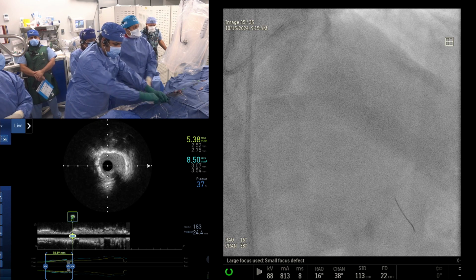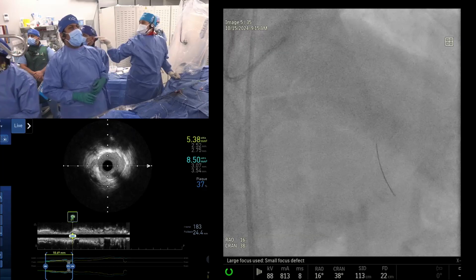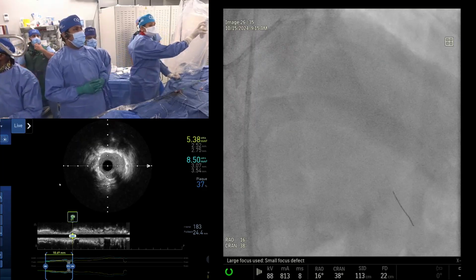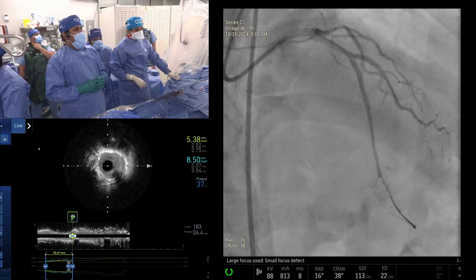So let's finish it now. And you tell us whether drug-coated balloon or not. The ostial diagonal is 5.0. It's very good. Okay. Only one question remains: drug-coated balloon or no drug-coated balloon? Another $5,600 expense or not?